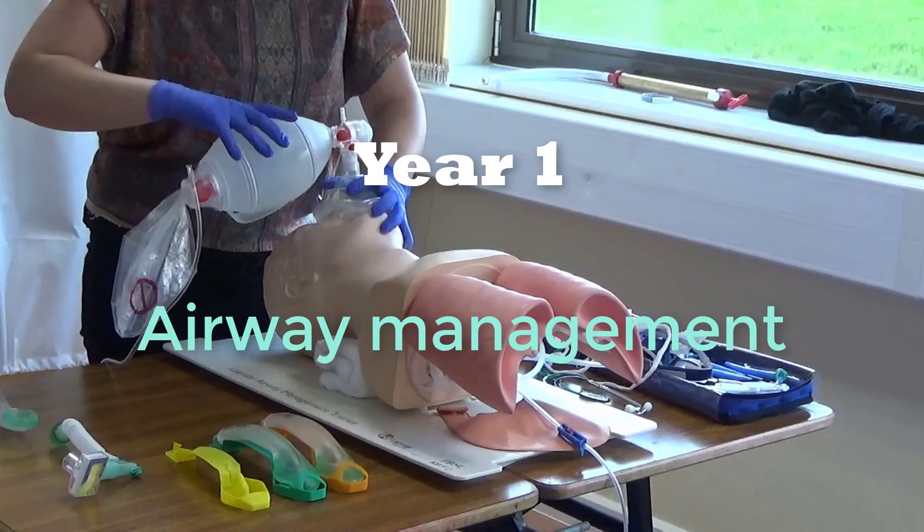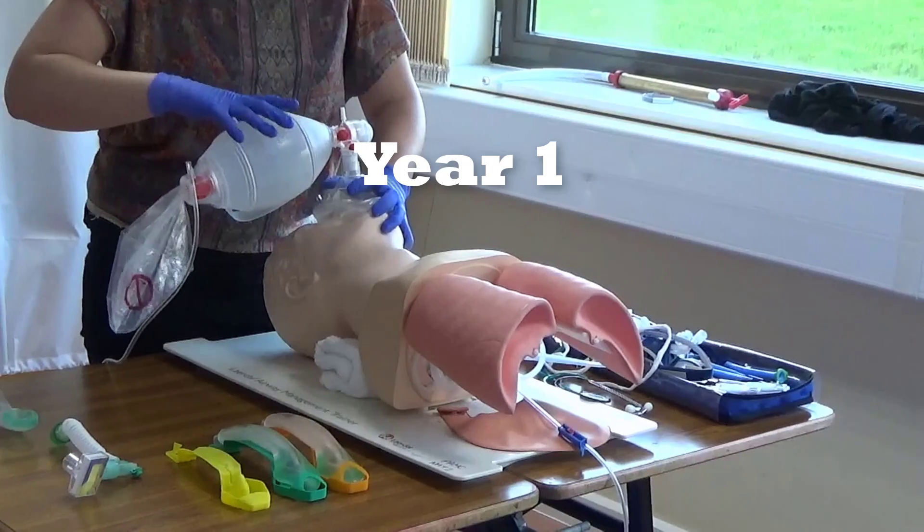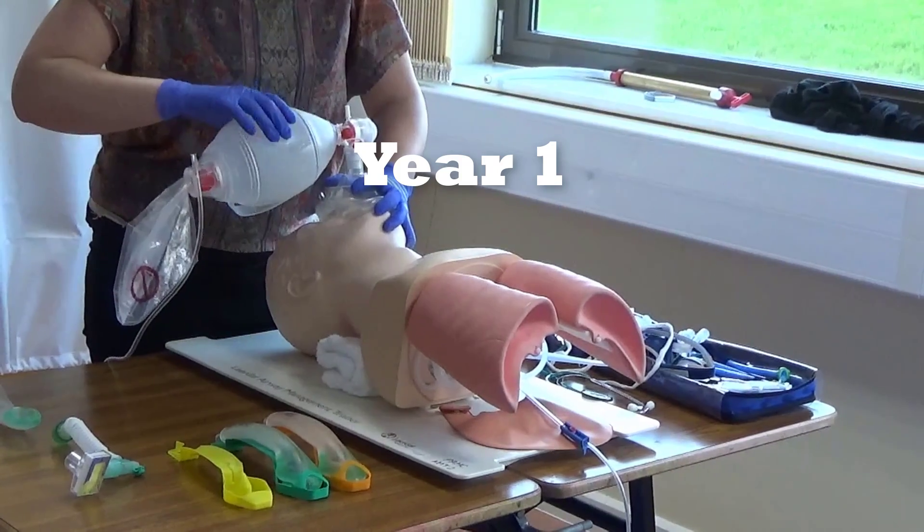This clinical skills video is going to focus on airway management. We're going to run through a stepwise airway management approach.